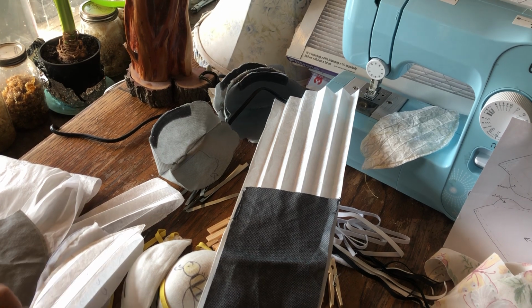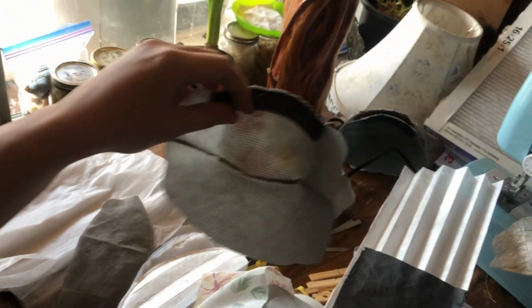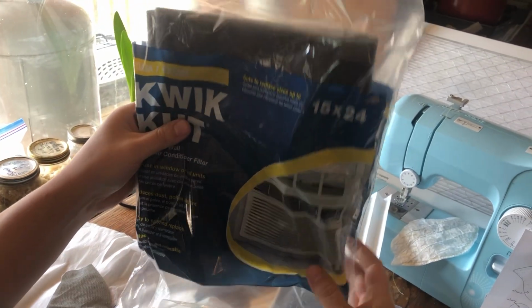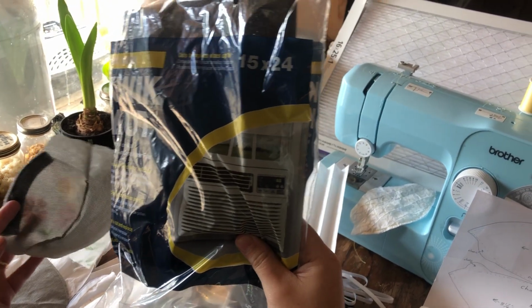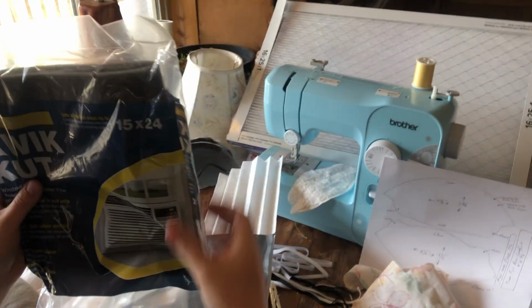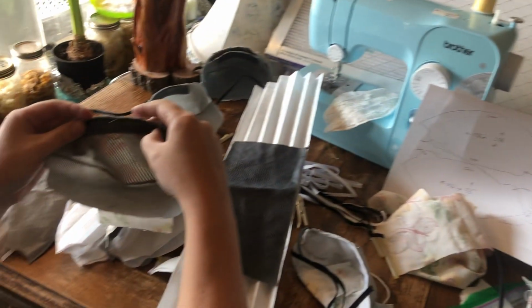Then I'm taking and sewing my nose cushion in. What I used for this was I found some air conditioning filter material at Ace Hardware, and I would think you could use weather strip and things like that, and some sort of nice soft squishy foam that would feel comfortable as a nose thing. And so I put this on the outside first. This was itchy. This was not comfortable.